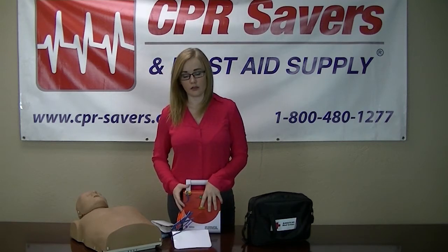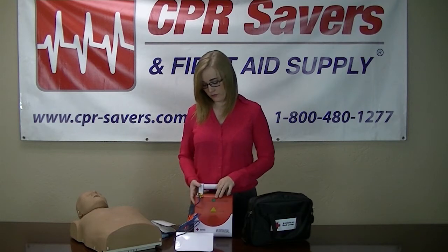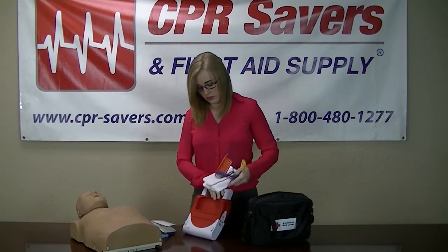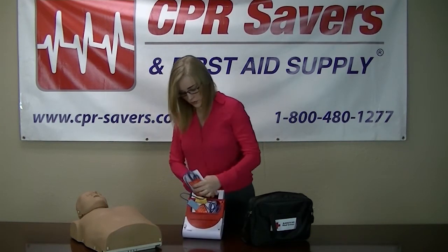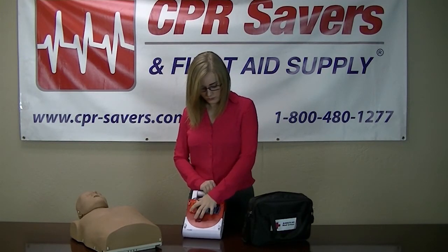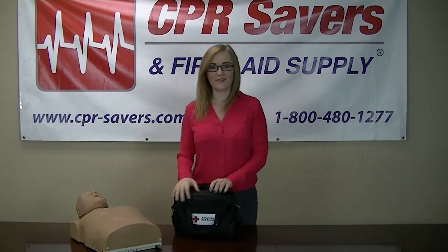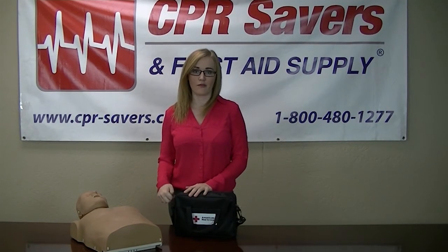Then you're going to start your training. Once you're done, just turn the unit off. Unplug your pads. You can store them back in the back of each unit — both pairs fit in there. Just put it back in your bag and you're done. My name is Layne. I'm here with CPR Savers and First Aid Supply, and this is the American Red Cross Trainer.